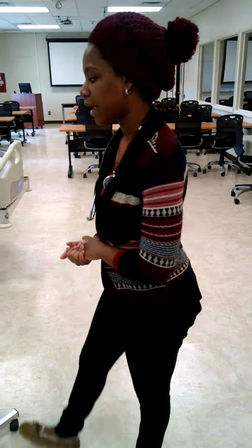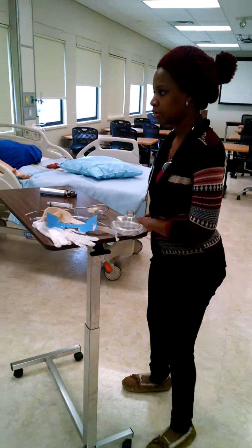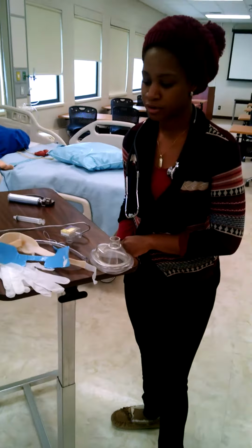At this point, I went over the patient's chart for any significant findings, data, and patient history. According to the physician's order, this patient needs to be extubated today. I've already looked at his current FiO2, and I've gathered my belongings, which includes an emergency intubation tray.